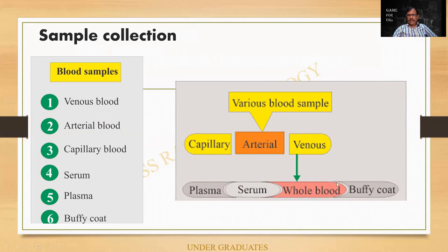So these are the various samples, and I want you to kindly know them because the examiner will definitely be asking different questions to different students. It is not difficult. The problem is we think it is not important and we pay the penalty for it.